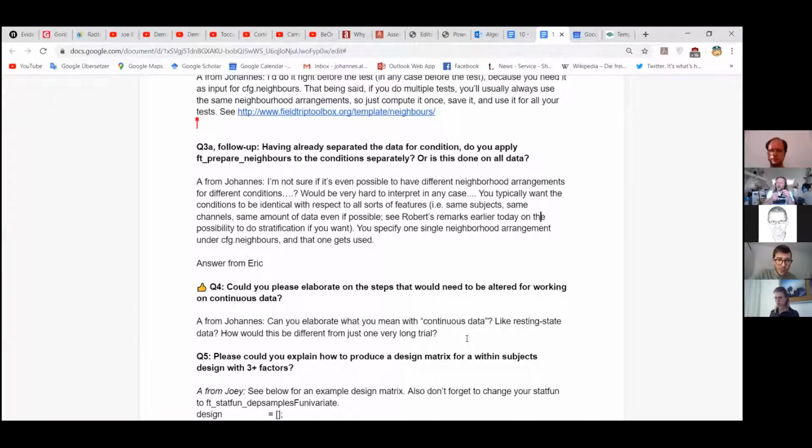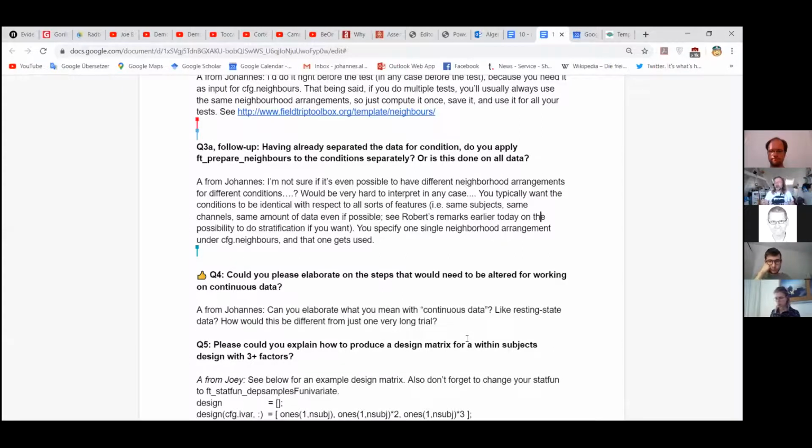Actually, if you remember the data set that we've been working on so far, it also had two broken channels, which were here on the left parietal lobe, more or less. So here at the back, there were two channels missing. The consequence of this is that channels on the left parietal area have fewer neighbors. So it's more difficult to compile evidence for there being a significant effect over that brain region. So with the data that we've been using in the playground so far, it's also not totally unbiased. We would be more sensitive to effects in the right hemisphere than effects in the left hemisphere.